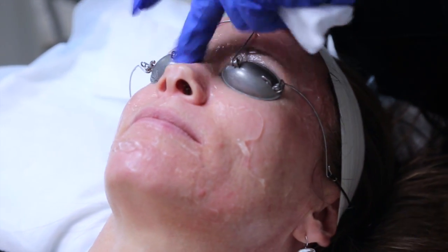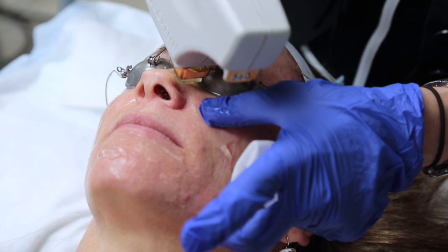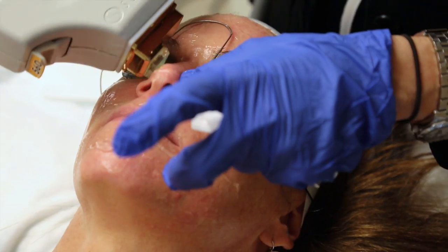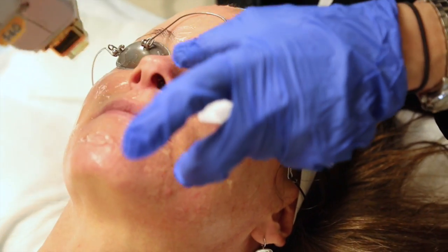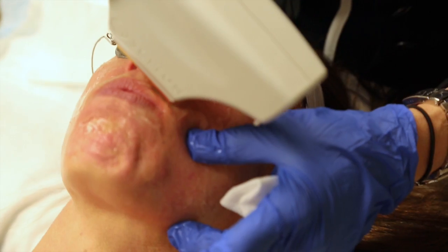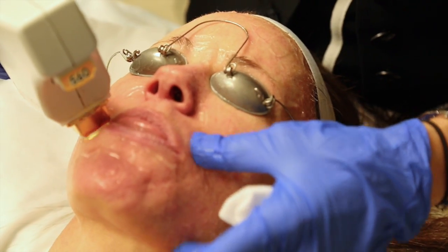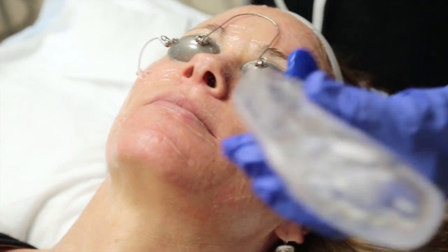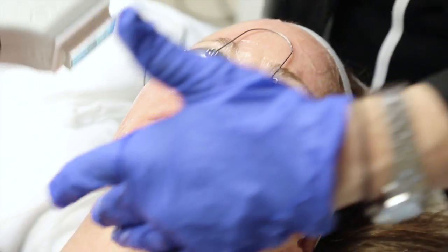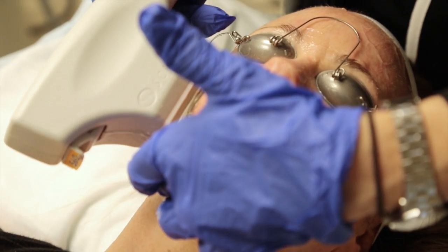I've had patients comment that they think it's sort of strange that I'm using light to treat damage caused by light. And that's actually true, but what we're using is the wavelengths that are available in sunlight that have healing properties. It's ultraviolet light that causes the issue. So with the exception of people who have aloe vera allergies, I do like to use aloe as my gel instead of just ultrasound gel, because it does calm the redness as we go along.